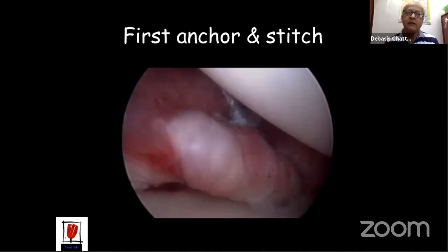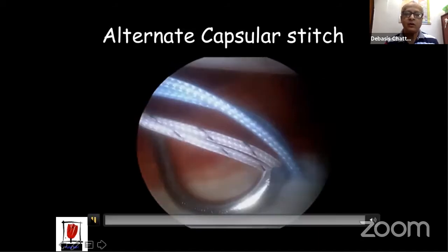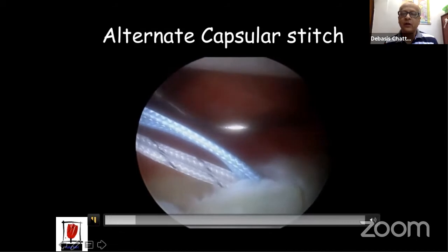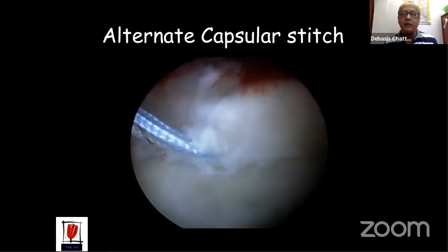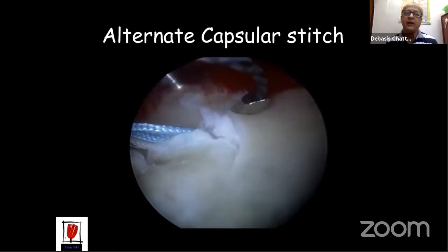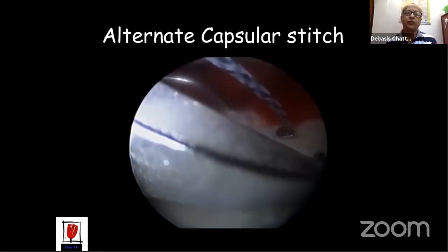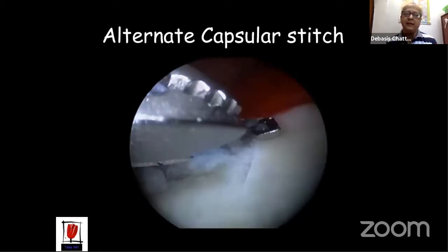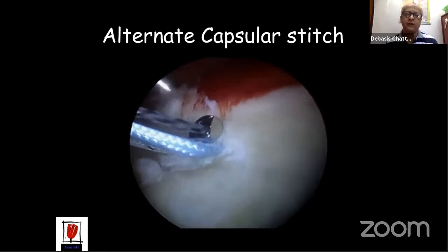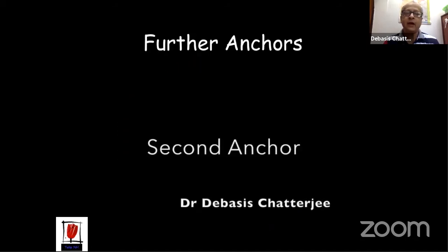There are also other methods to take this bite using what is known as a crescent hook or one of those suture hooks, where you take a bite through the inferior part and through these hollow hooks, there is a shuttling thread, whatever you want, through which you can take the suture of the anchor through the capsule, completing your capsular bite. It's your choice.